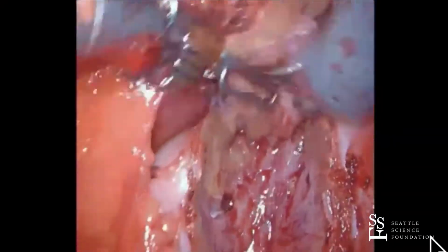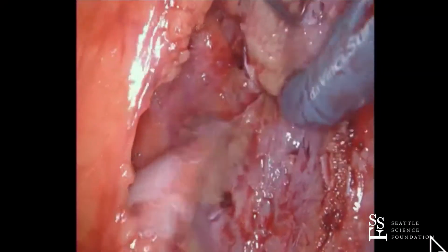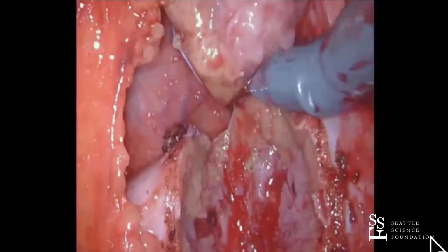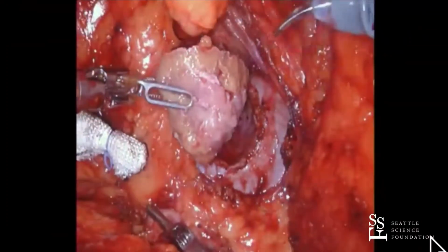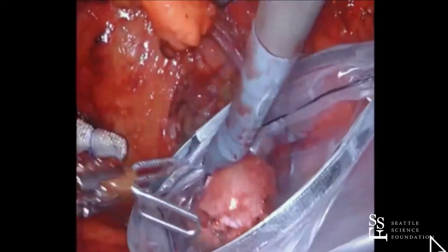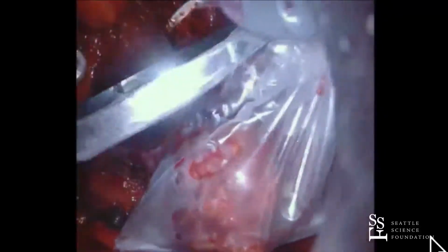The other nice move he's doing, and you don't pick up on it, is this blunt brush with the tip of the scissor. As you come around the back turn of the tumor, if you're not sure if there's more, if you just brush it, stroke it with the tip of the scissor, the parenchyma will lead you to the right place. Instead of taking blind cuts in the back, you could get into the tumor that way.